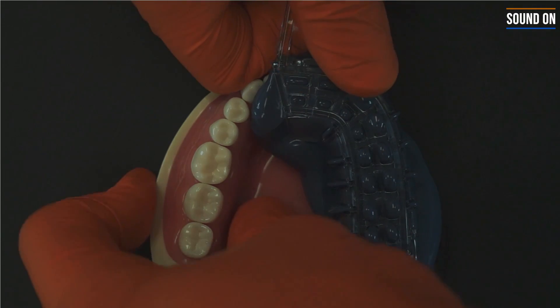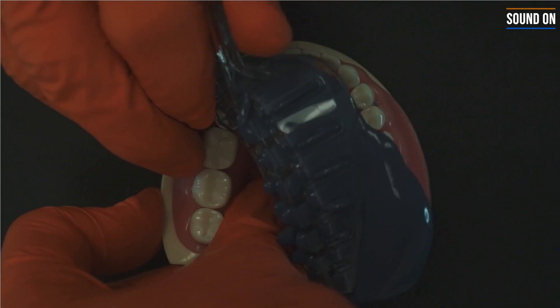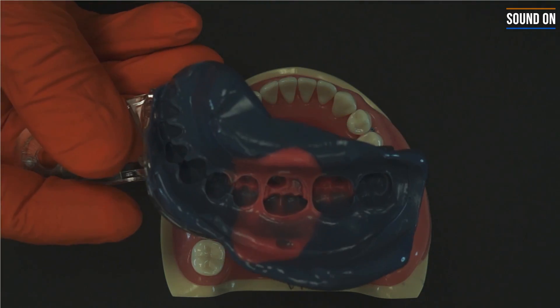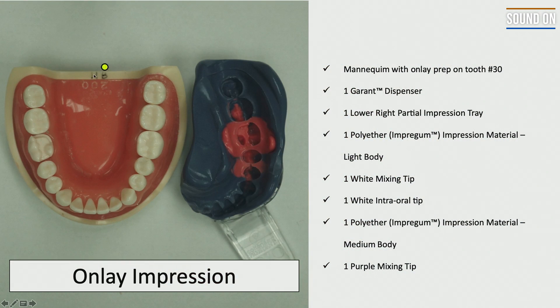One important thing is to wait the setting time of the material, and then you're ready to remove. You should be able to complete that and copy all the finishing lines without any air bubbles. The goal here is to make sure that you copy all the finishing lines of the prep, and you should be able to identify those areas.